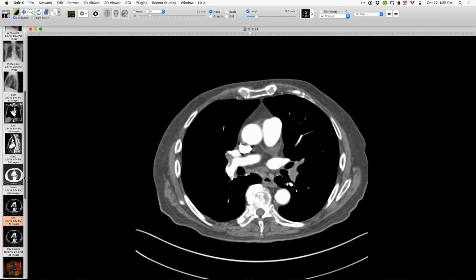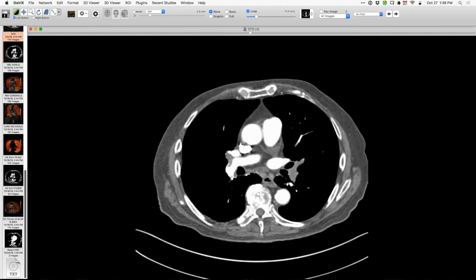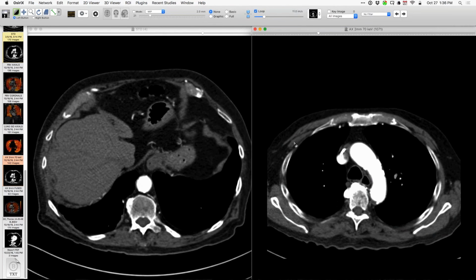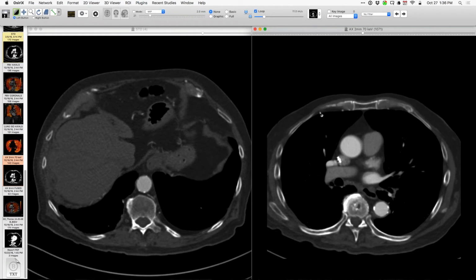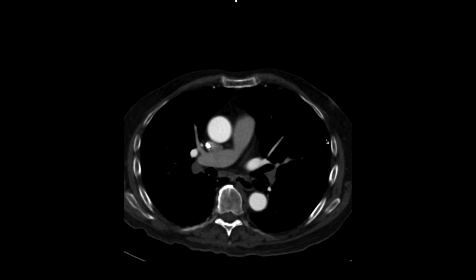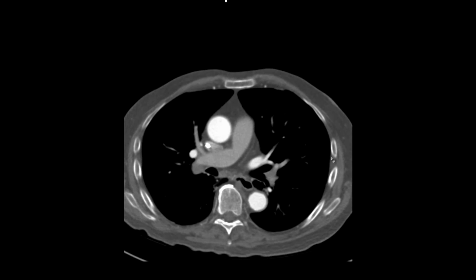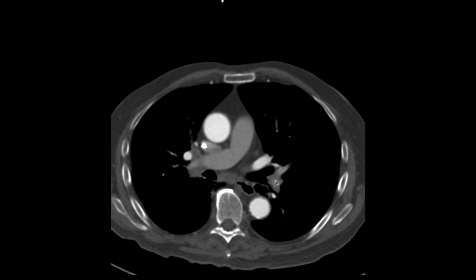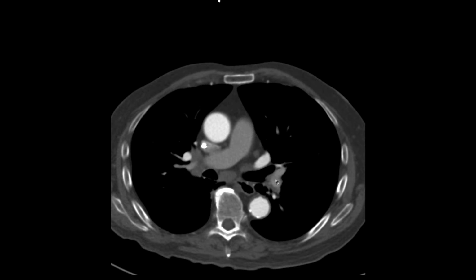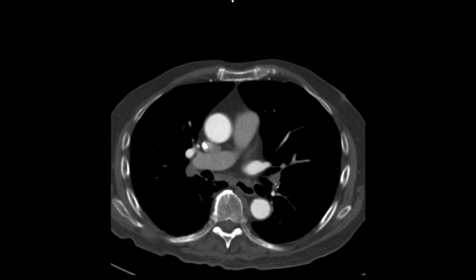So what I'll show you next is the follow-up, which is from this month. Let me bring up October alongside that. And here you will see that everything has resolved, quite substantially so too, except for the left lower lobe pulmonary artery. Notice how this left lower lobe pulmonary artery really has not opened at all. There's an abrupt transition between lumen here and presumably fibrotic thrombotic occlusion of that left lower pulmonary artery, which never opened and remained shut.